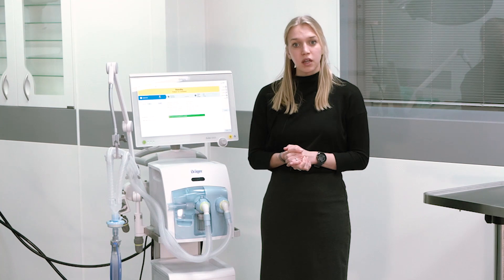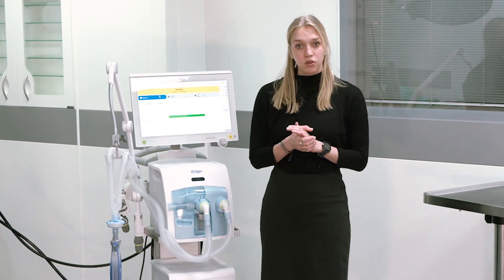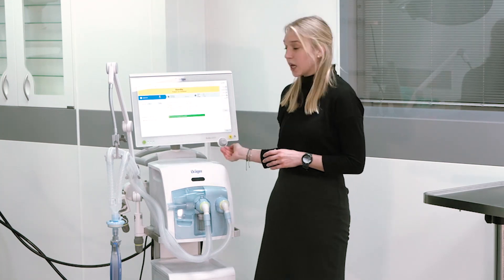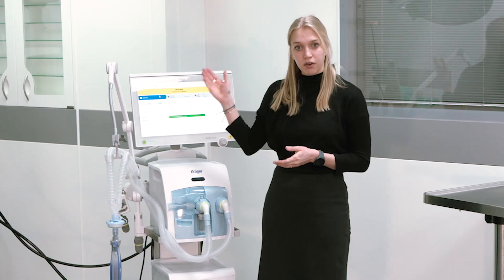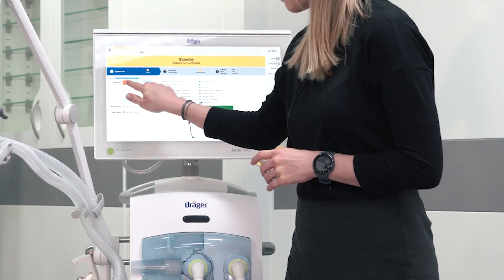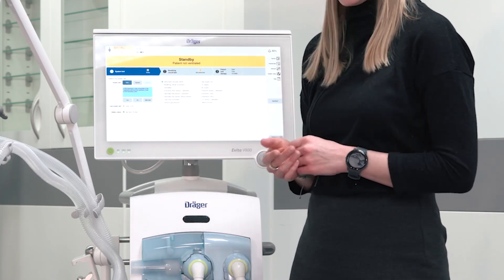Before starting ventilation, the ventilator will guide you through the three steps of preparation. To initiate the system test, please select the respective start field and confirm with the rotary knob. You can directly follow the instructions on the user interface.